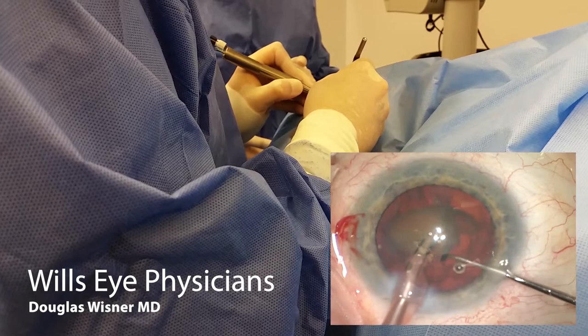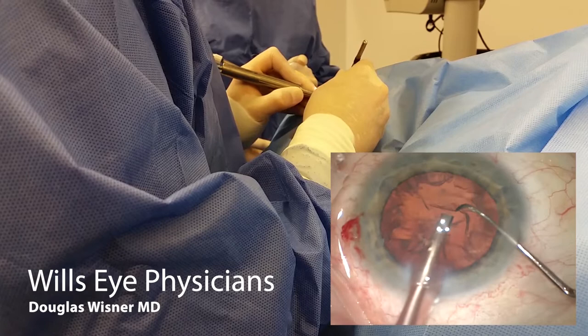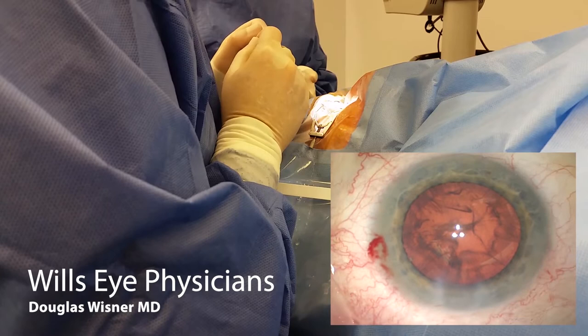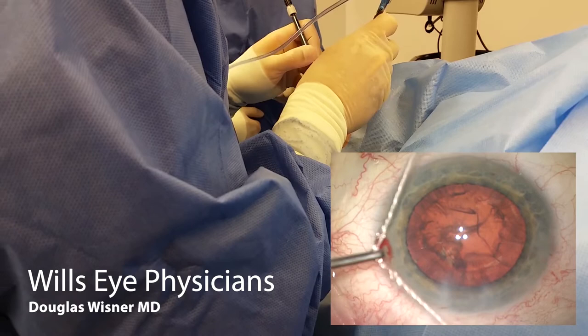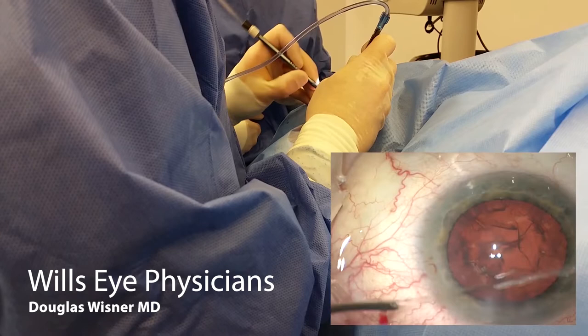You can see I'm just using my second instrument to primarily push things off. I'm using an active fluidics machine so the chamber is nice and stable as long as I'm not pushing down on my wounds. I'm not using my second instrument to push the bag back because I should, if I'm a good surgeon, be allowing the fluid to do that. So we got all the cortex out; everything looks okay. Using bimanual IA here, which is my preferred technique because you have two incisions, you can switch back and forth — you never need to struggle with subincisional cortex.